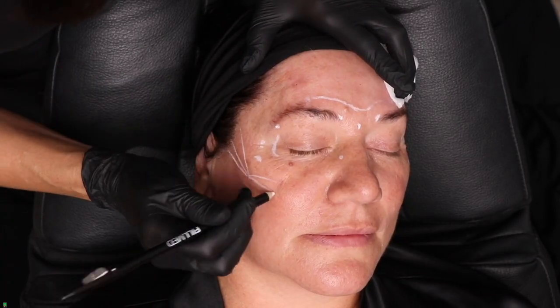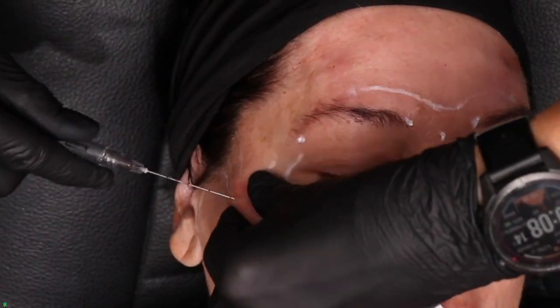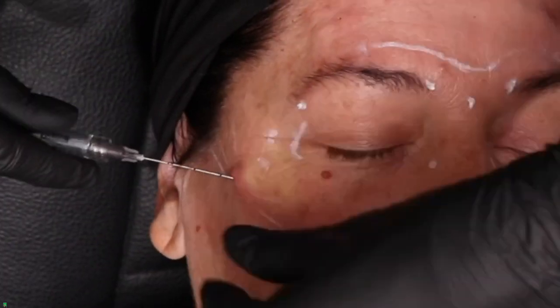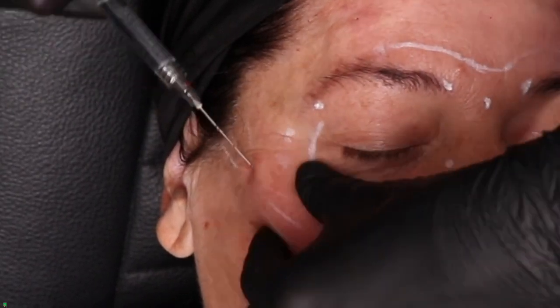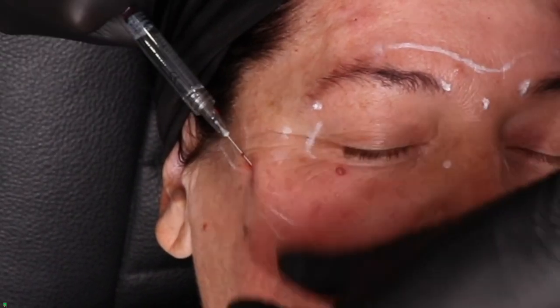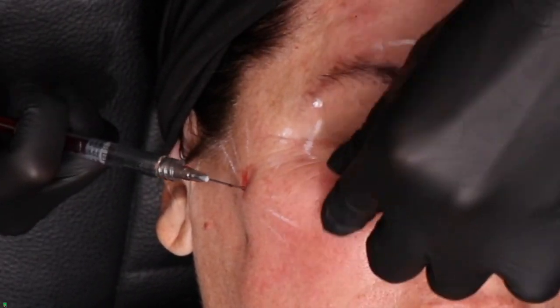Then we move on to the cannula technique. Now, the cannula technique is so much safer. We use a 22 gauge cannula of either 50 or 70 millimeters. With one entry point and a blunt cannula, we can move to lateral, we can go to medial, to the most anterior medial cheek zone areas.